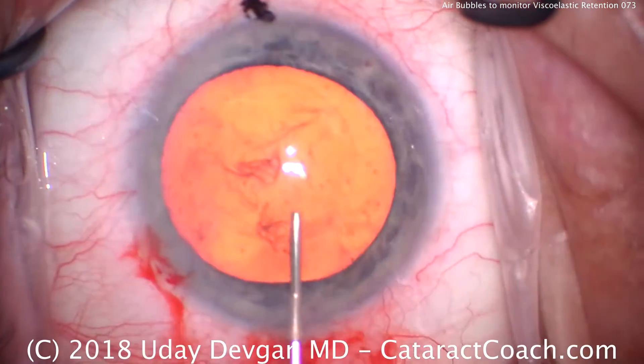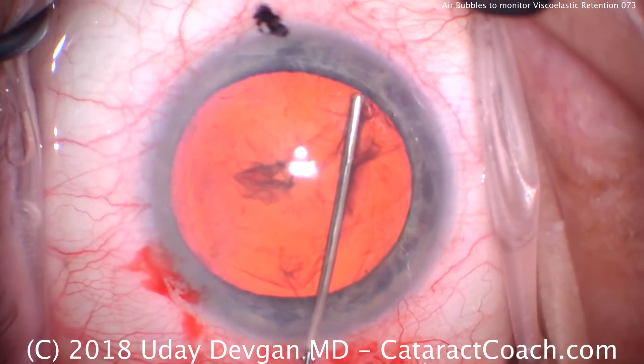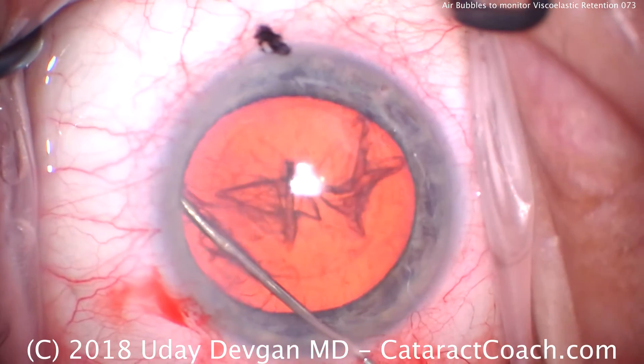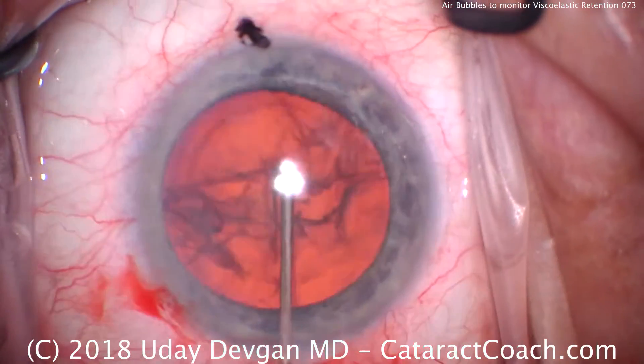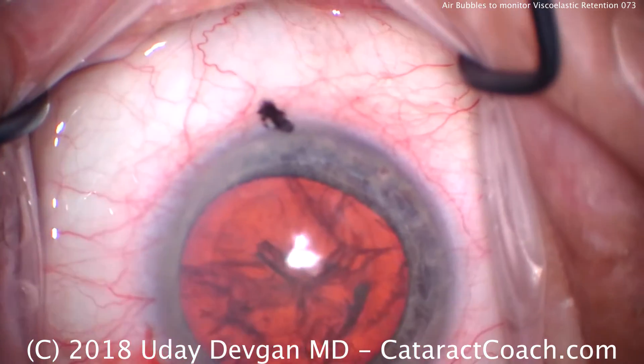Here comes some balanced salt solution and a blunt cannula for hydrodissection. We get a few fluid waves. Note here how we tend to lose a little viscoelastic when we do this. We want a good hydrodissection and rotation of the nucleus — that looks great.